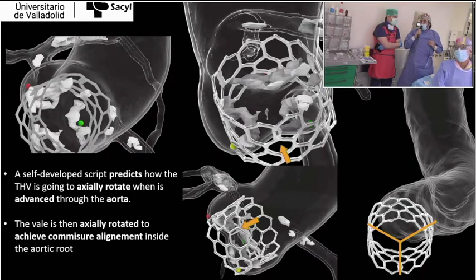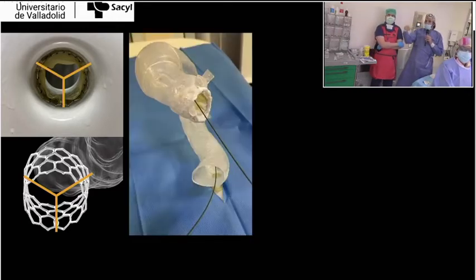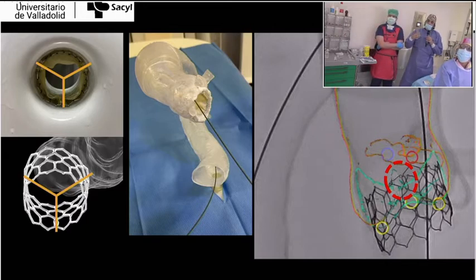In order to be able to do this, we need to introduce the valve with a certain rotation position. You can see on the right of the presentation, we have to put one commissural post pointing down. So we did that. You can see in the top image the valve inside the crimper, with one post pointing down. We decided this in vitro in a 3D model. This is a 3D printed model created from the CT scan of this patient, and we implanted with this orientation. And you can see on the right the Heart Navigator tool from Philips, overlaid on top of the angiogram of the model.